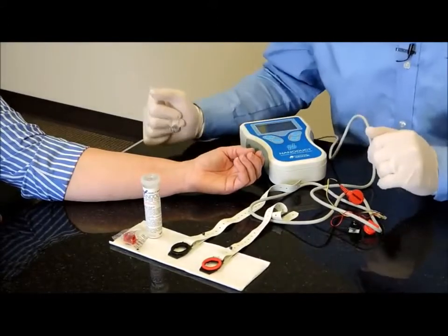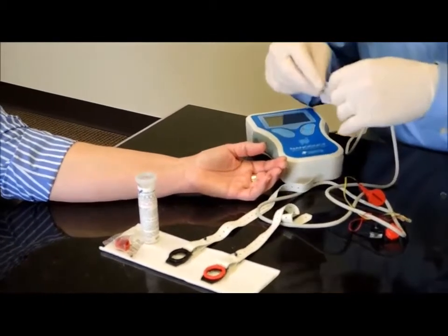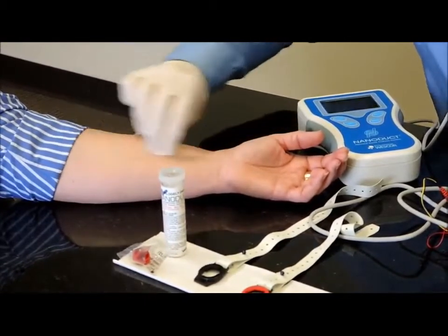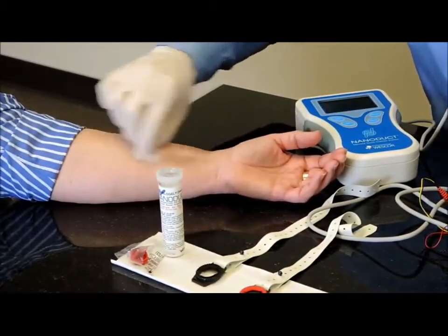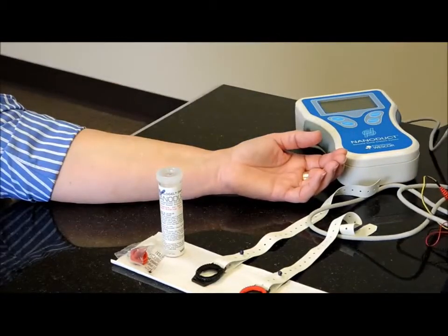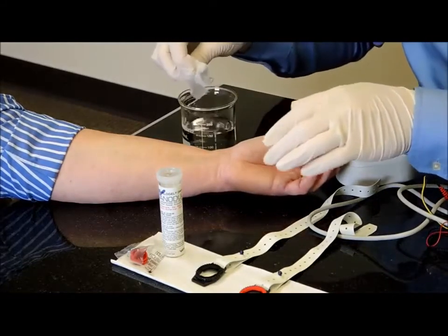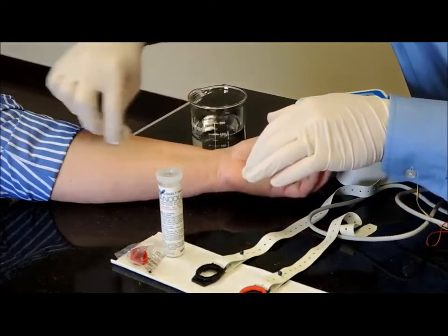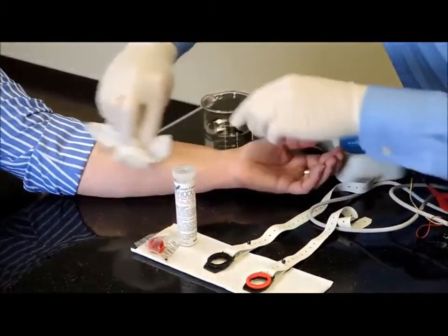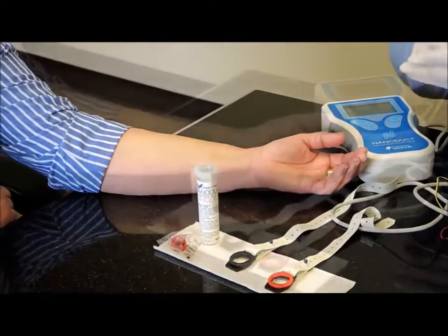Before I attach the straps to the patient, I'm going to wash the patient's arm. So the first step in washing is to use the alcohol prep pads to wash the arm. We do that to remove any lotions or anything else that might have some chloride or other ionic ions in there. So we just wash that real well. Then we follow that with a Kim wipe and some water, and use ample amounts of water. Okay, and then after that we'll dry. So once it's dry, we're ready to apply the straps and get started.